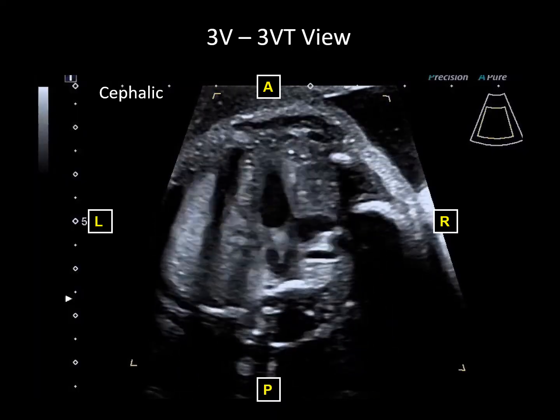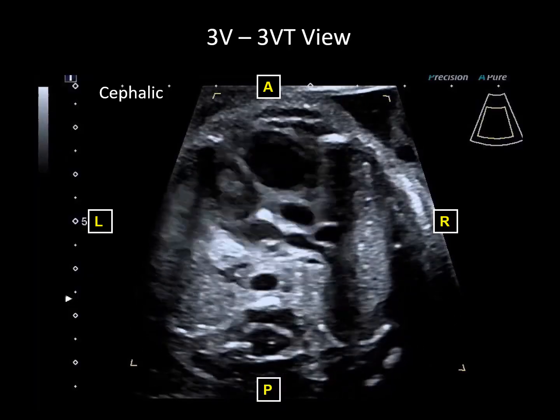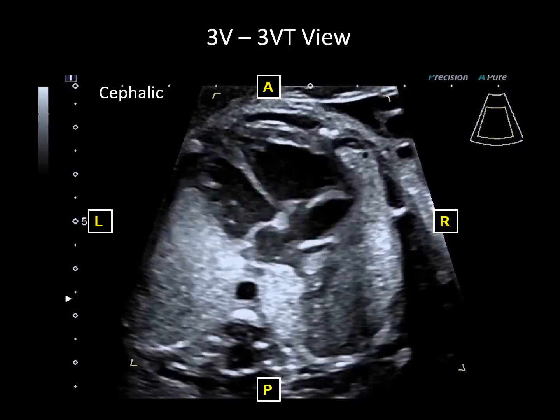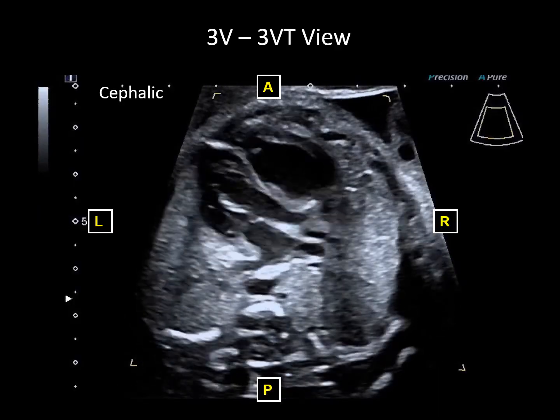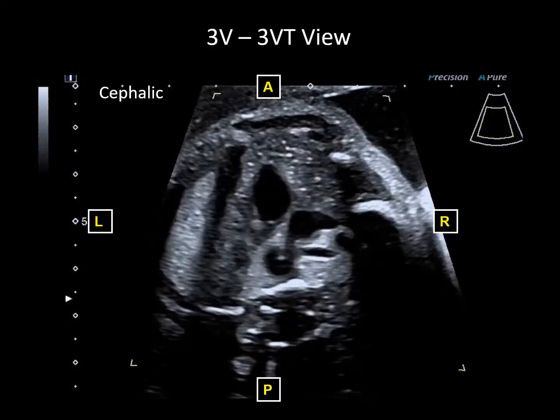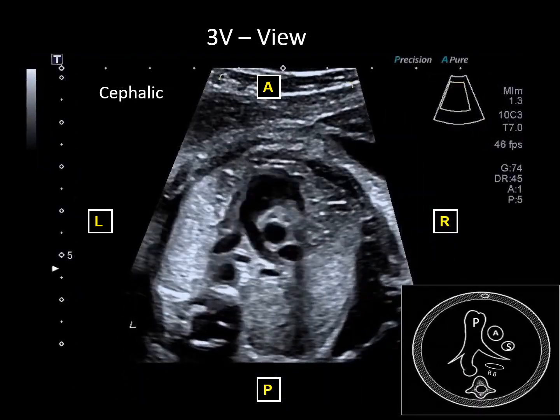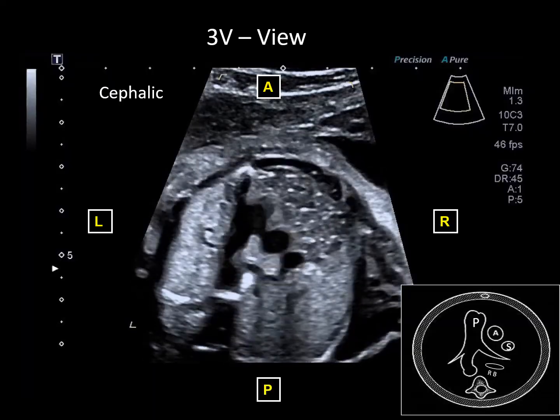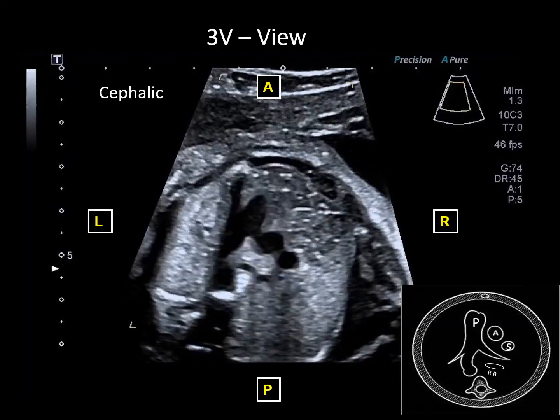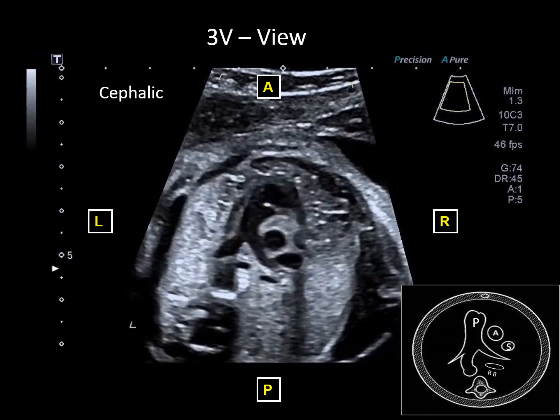There's the trachea and the carina with the bronchi there shown. All of these structures are in transition as you're sweeping up, and you can see these structures clearly as you freeze and sweep and scroll through the sweep in review of this. Now, as we're moving up the chest to these views, we're going to settle in on a view, and we're going to watch it and interrogate it here with a nice long cine clip looking at the structures.